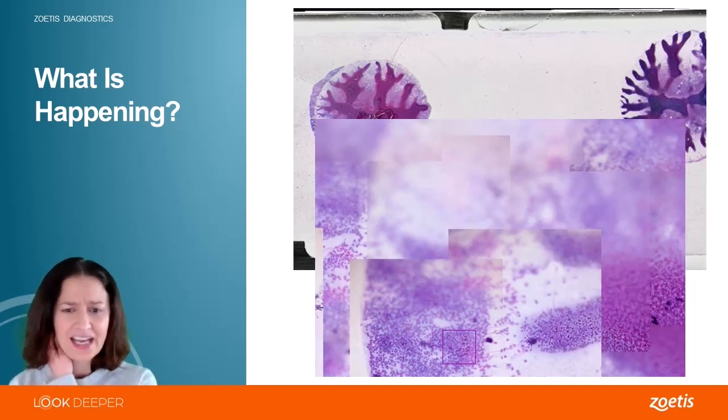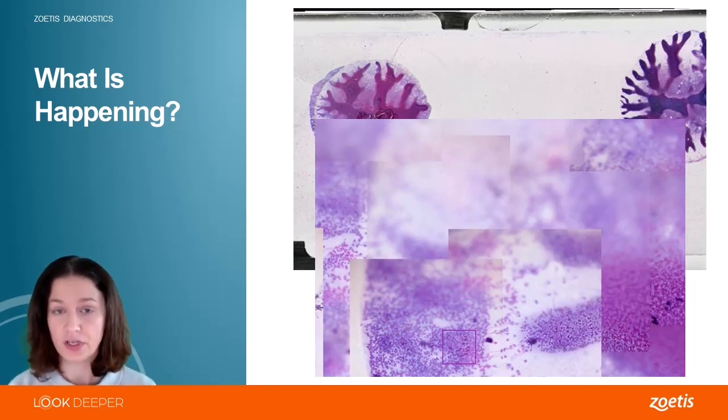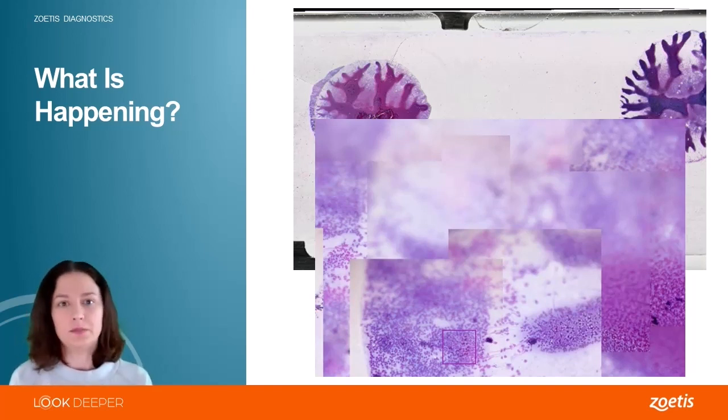The other times that this actually happens is if this Imagyst is sharing a tabletop with the centrifuge and the centrifuge is on, it's actually vibrating the table. And that can vibrate the Imagyst and it can vibrate the slide. And then this is kind of what I see, intermittent in-focus areas with blurry areas. And unfortunately with this, I'm losing a lot of the field.